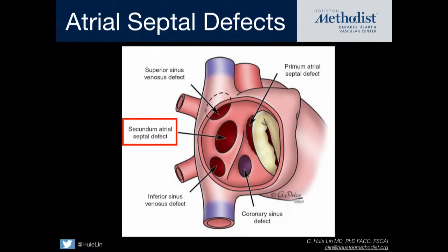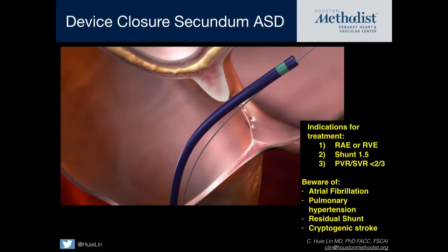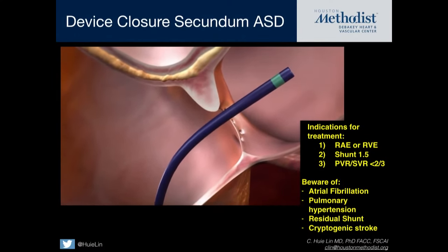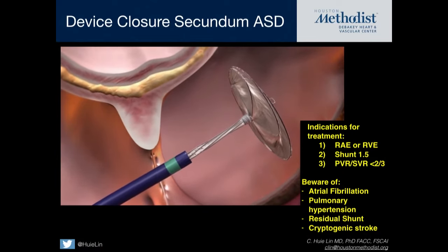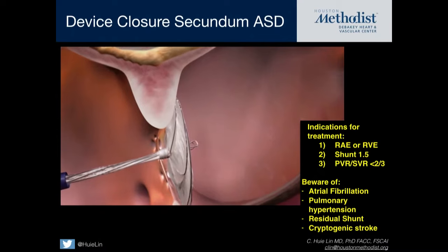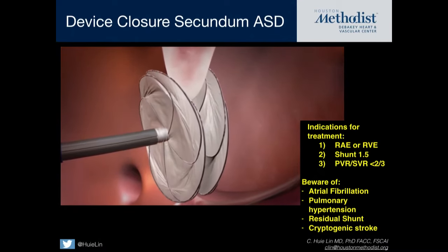So focusing specifically on the secundum atrial septal defect, this also happens to be, in addition to being the most common, also the lesion that we can actually treat with transcatheter techniques on a regular basis. And so currently there are a couple of FDA-approved devices. This is one of the two FDA-approved devices. These are the typical indications for treatment.